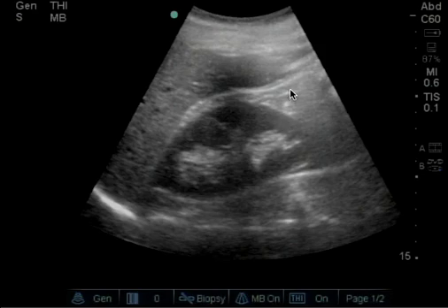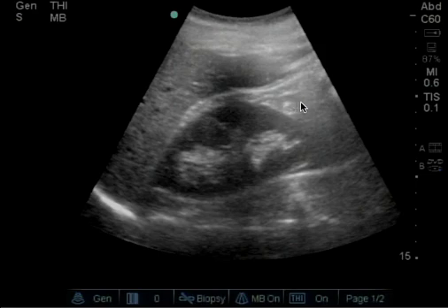Once again, the double line with internal echoes in between shows normal anatomic structures and perinephric fat. This should not be considered free fluid.